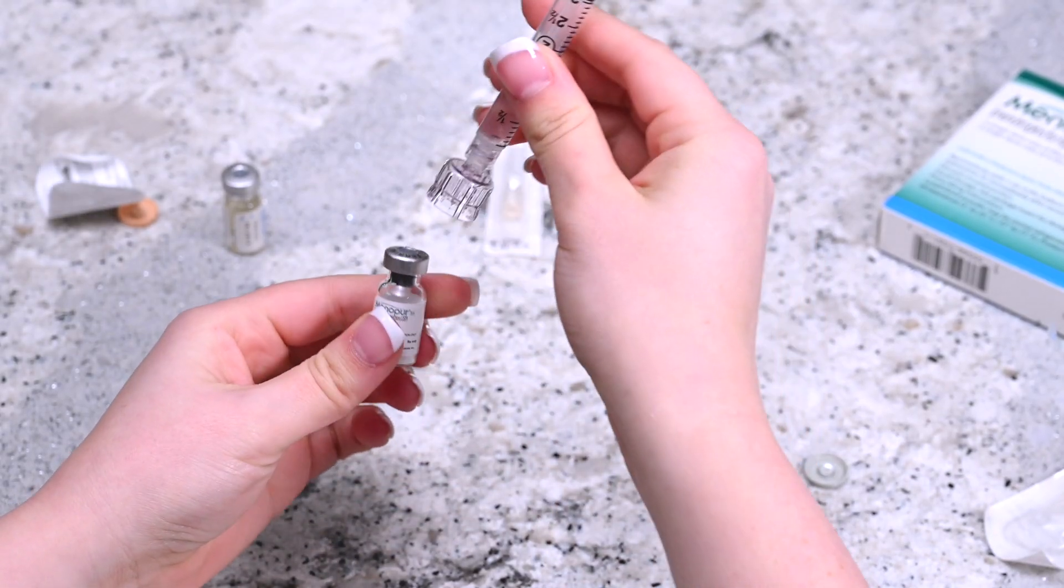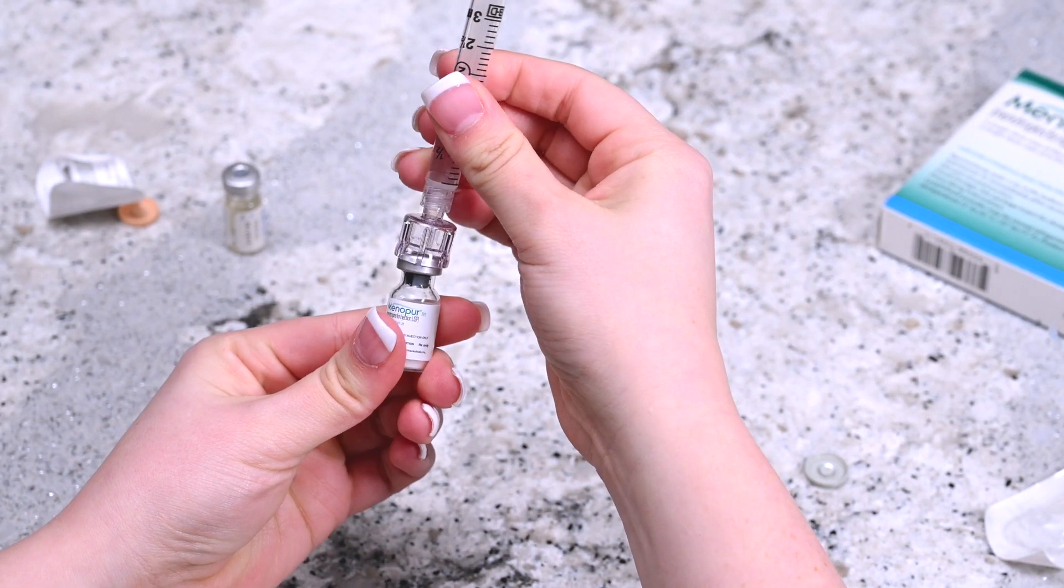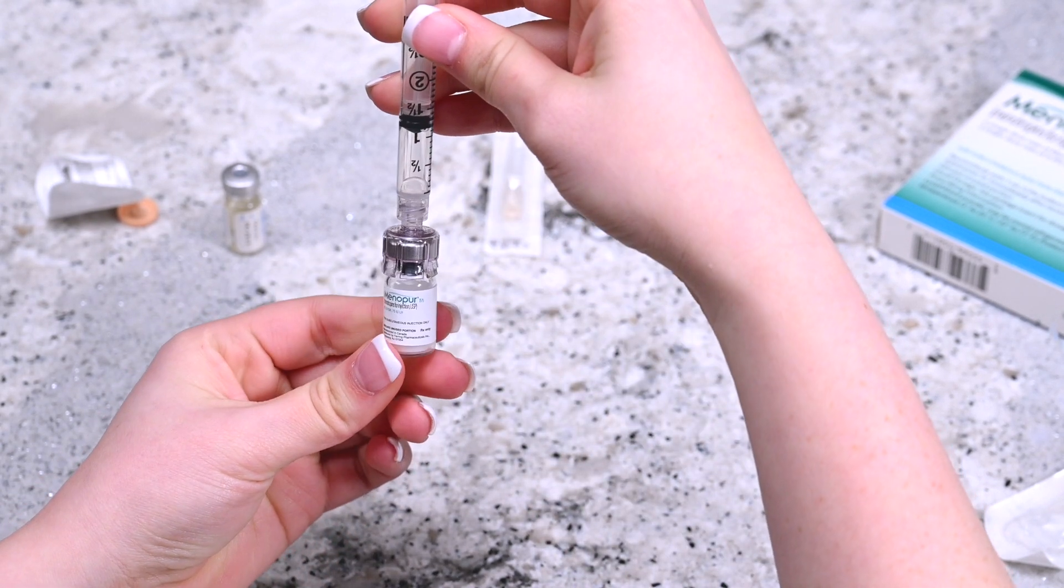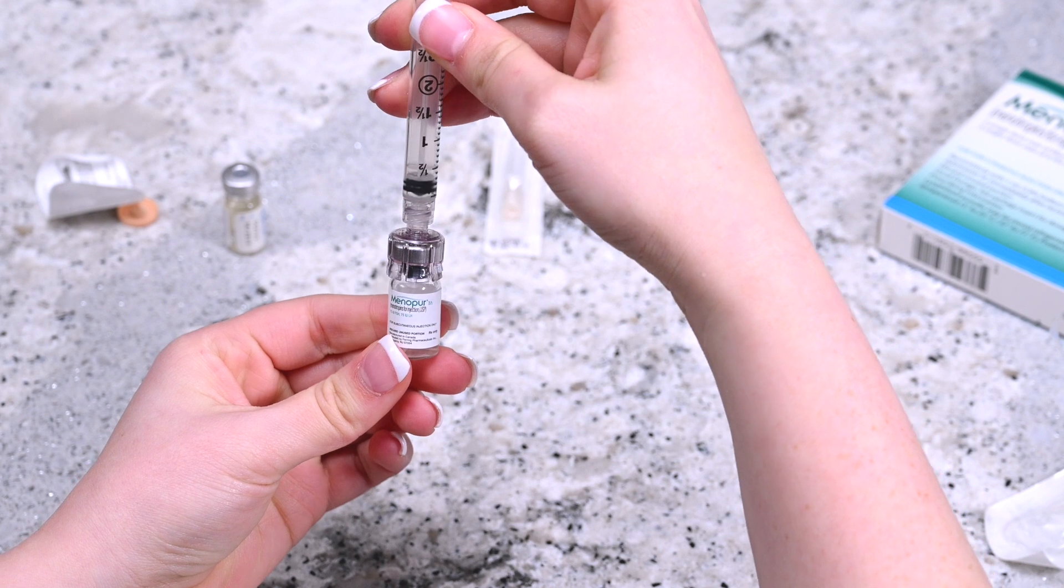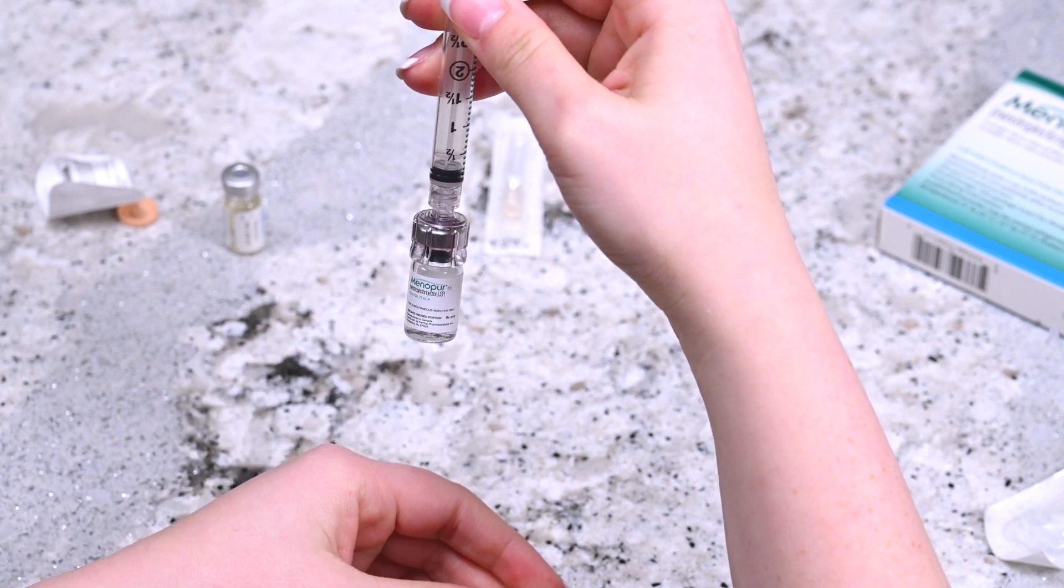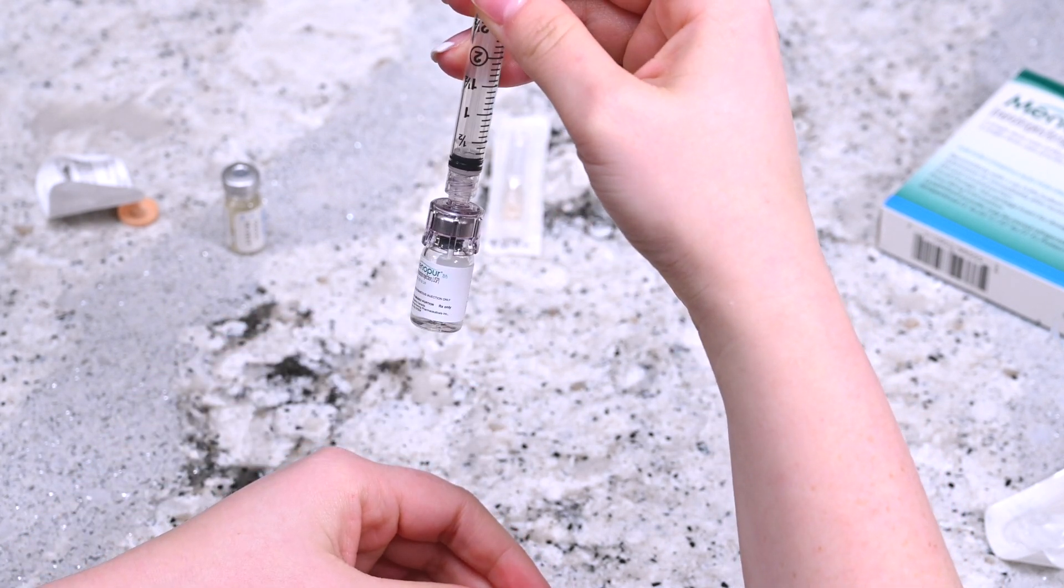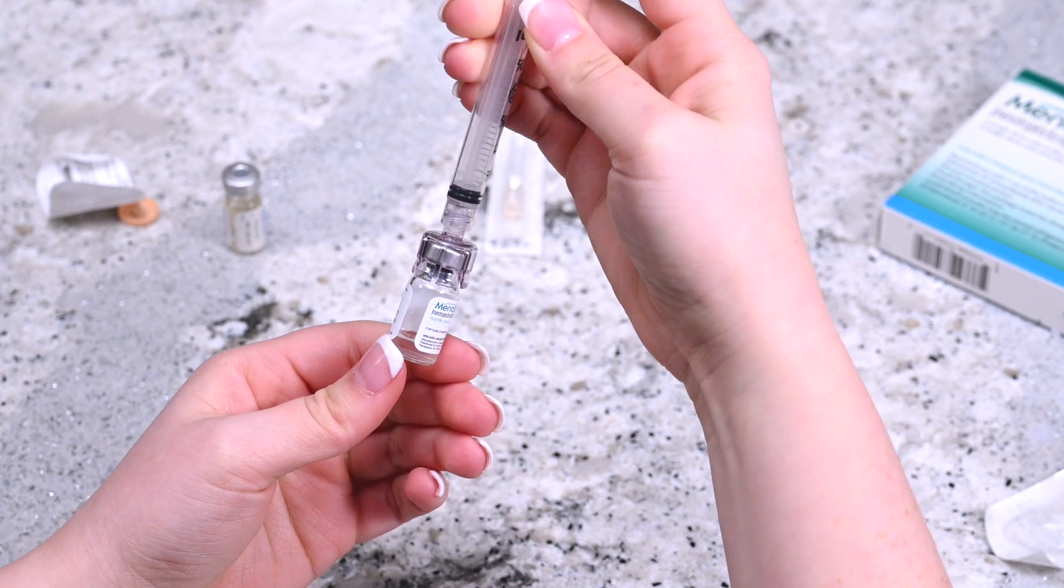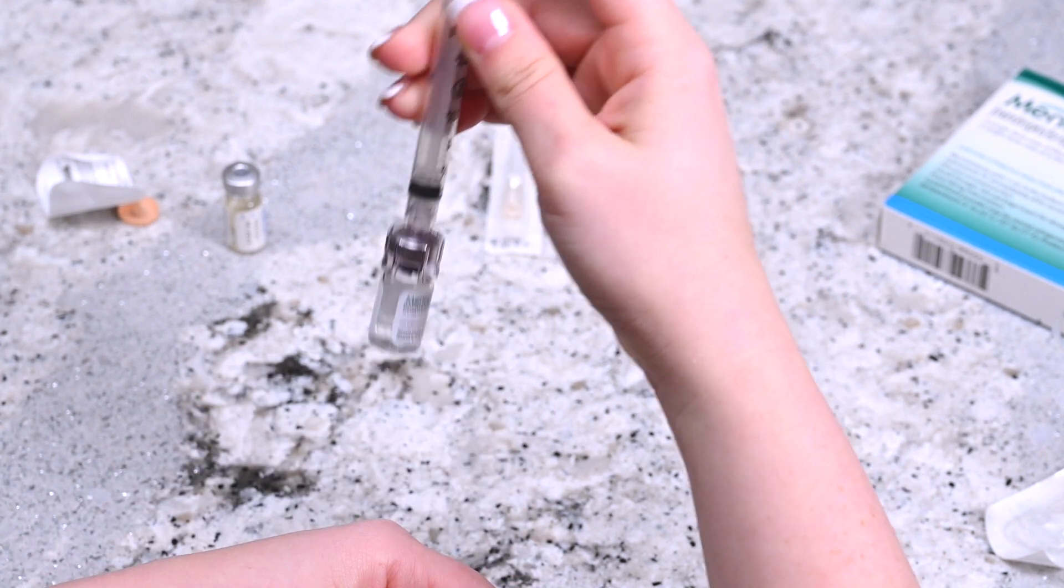Insert the q-cap into the rubber stopper on the vial of Menopur powder and release the syringe's content into it by pressing on the plunger. After releasing all the liquid into the vial of Menopur powder, gently mix the contents until the powder dissolves. Do not shake the vial.